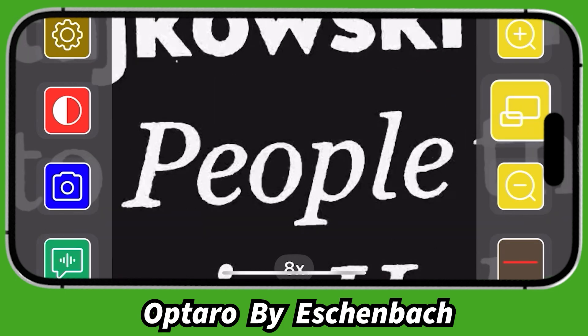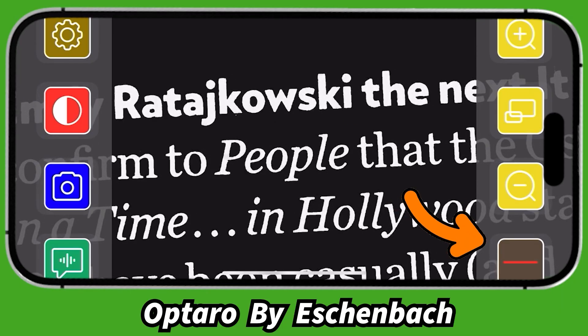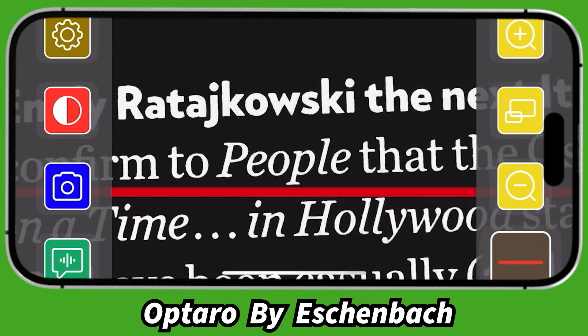There's also a control for a kind of picture-in-picture zoom toggle: if you're zoomed in to 5x and the minimum is 2x, hitting the button jumps you back to 2x, and hitting it again jumps back to 5x. Pretty nice feature. And finally at the bottom we have a red line in a brownish box — that's the reading lines and shades, or 'blinders.' Hitting that gives a horizontal red line. You can change the thickness, position, and orientation — horizontal or vertical — and switch between lines and windowing in the settings.